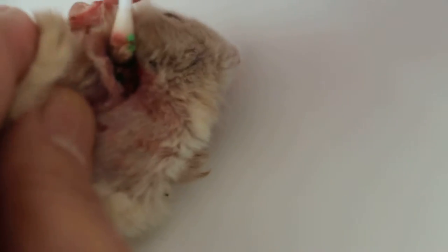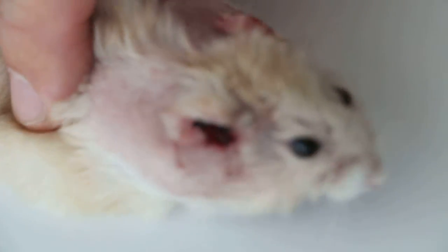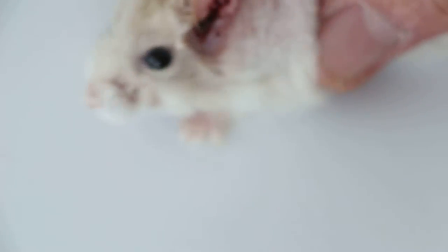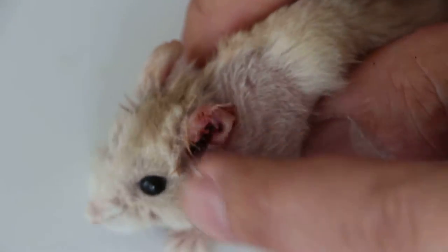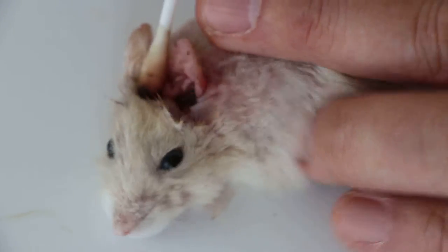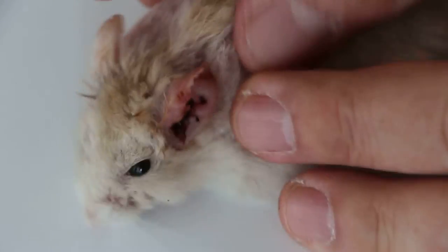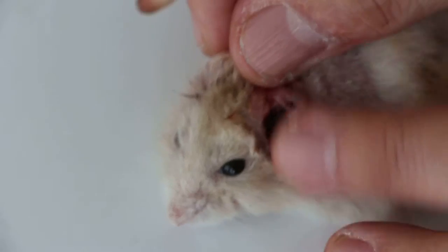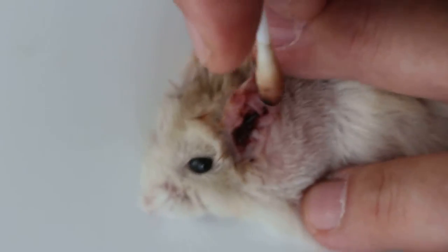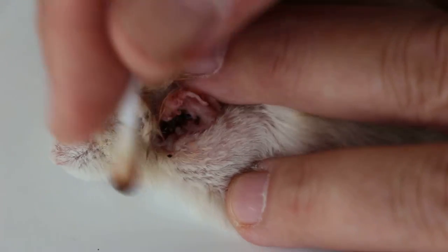Of course you don't do it until the hamster is stressed out — we just do it for maybe 2 minutes and then stop, then do it again. That's how you do the post-op care. The blood and bleeding has already been removed by my assistant so you can't see any blood clots. These are all potassium permanganate powders which have to be removed slowly.